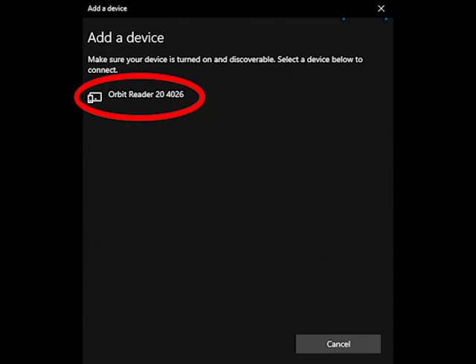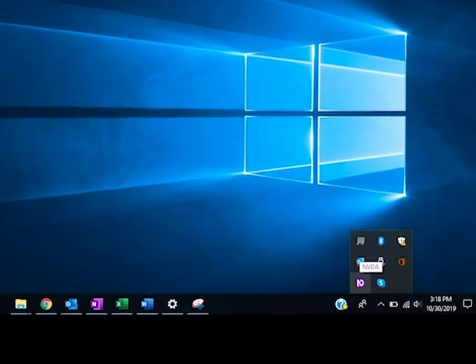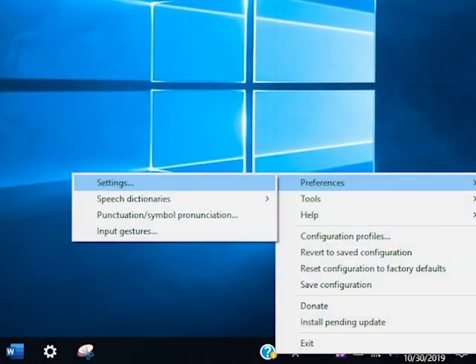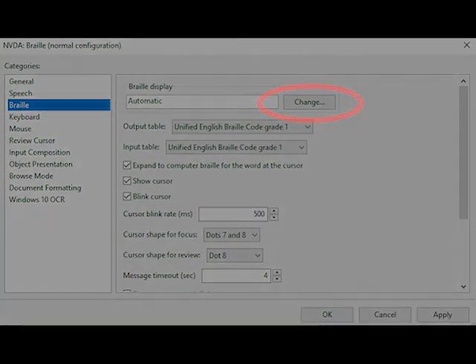NVDA will then automatically recognize your device. If NVDA does not recognize your device, go to NVDA Preferences. Select Braille Settings from the list, and then select Orbit Braille Displays as the Braille display, and Automatic under the Port Settings.